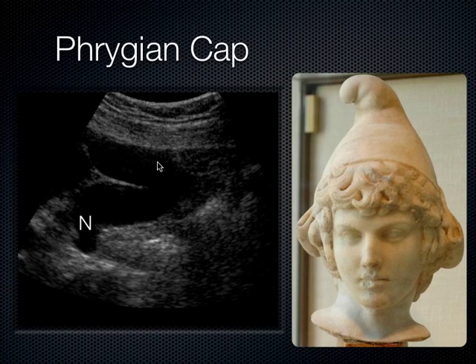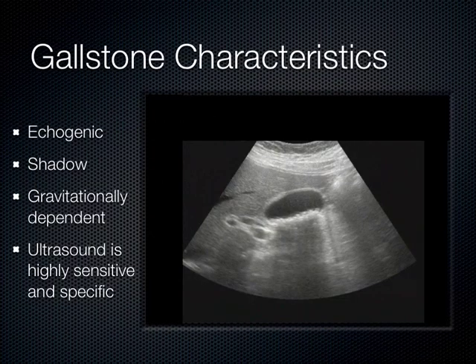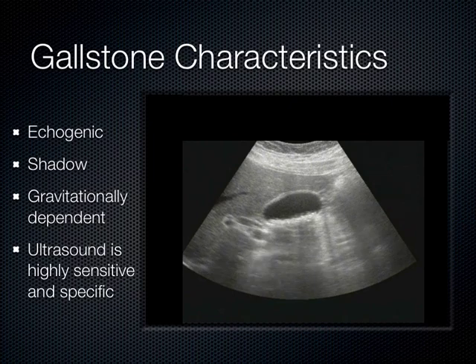And so sometimes you follow these gallbladders throughout all their folds. Just keep in mind that the concept of a gallbladder that's septated is almost impossible. In fact, I've never even seen one. People call me, hey, we have a septated gallbladder. I go in there, and if I could just fan through enough, I'll find where it's confluent with the rest of itself, because it's just a fold. Does that make sense?